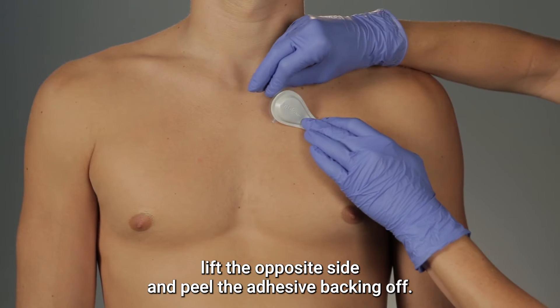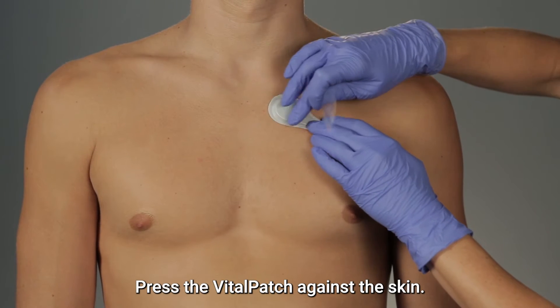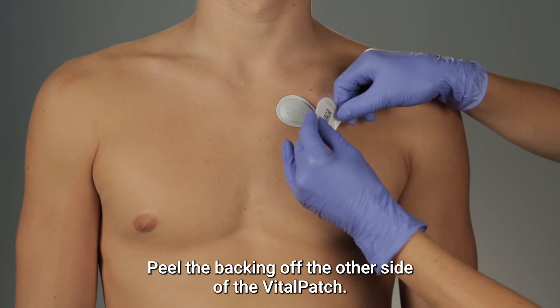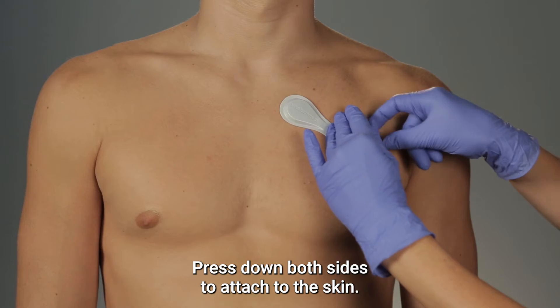While holding one side of the Vitalpatch down, lift the opposite side and peel the adhesive backing off. Press the Vitalpatch against the skin. Then peel the backing off the other side and press down both sides to attach to the skin.